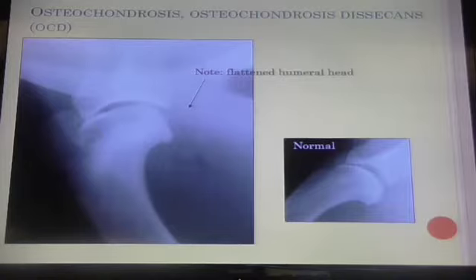So radiographically, you can only call it for what you see. When you go in surgically, there may be several joint bodies, but you can't call that on your films because you don't see them. You just know that there could be. All right, now, did that answer your question? No. Okay, good. Any other questions?